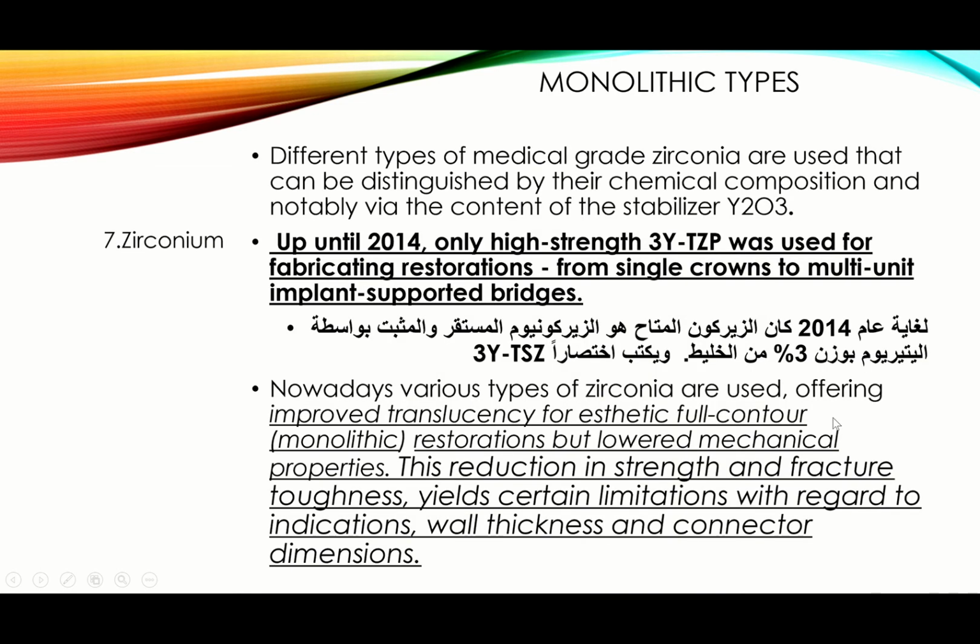Now, up until 2014, only high-strength 3 yttrium tetragonal stabilized zirconia was used for fabricating restorations, from single crowns to multi-unit implant-supported bridges. Of course, it was used as a core, and then we veneer or layer or stack. We build up on top of that core. All right.